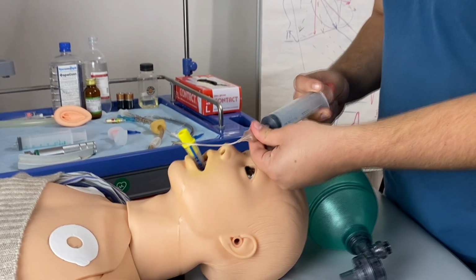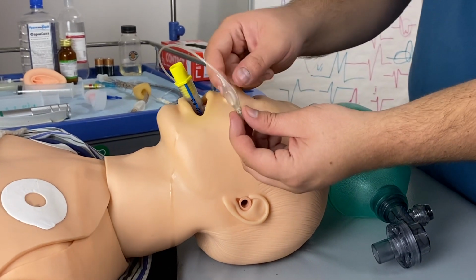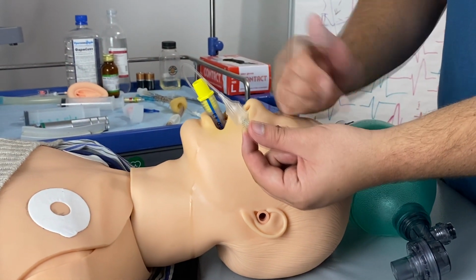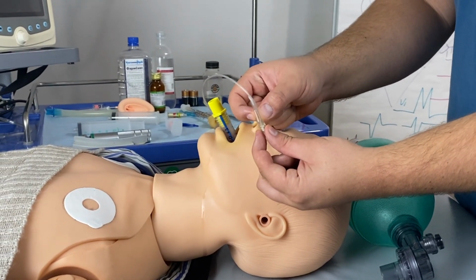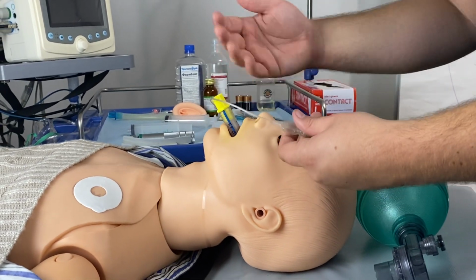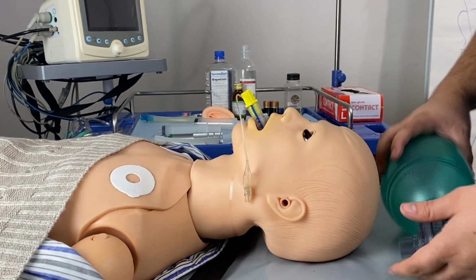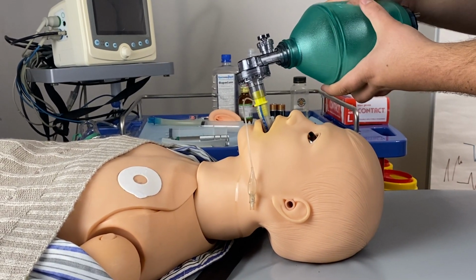On all the airway tubes, we have some type of indicators. So you see that now it's inflated, and we believe that the cuffs are inflated too, but we can easily compress it with our two fingers. That means that the pressure is not too much, and it will not cause additional damage for the patient. Now we can attach the bag and ventilate the patient.